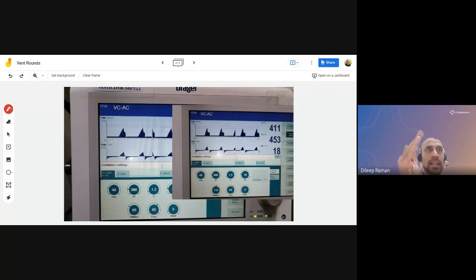If the pressure increases a little bit, it is going to cause an instantaneous increase in the flow. Then at the next millisecond, the flow will increase a little bit more because the pressure has risen a little bit more during the cycle. As the pressure keeps going up in a fixed interval, correspondingly, the flow behaves as a dependent variable. But the ventilator is not saying that I'm going to fix the flow throughout the breath at this rate, because the ventilator is not controlling the flow. The flow is a dependent variable. It's behaving because the pressure is acting on it over the course of the entire breath.